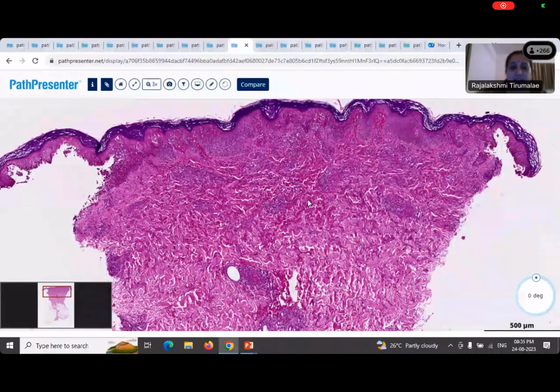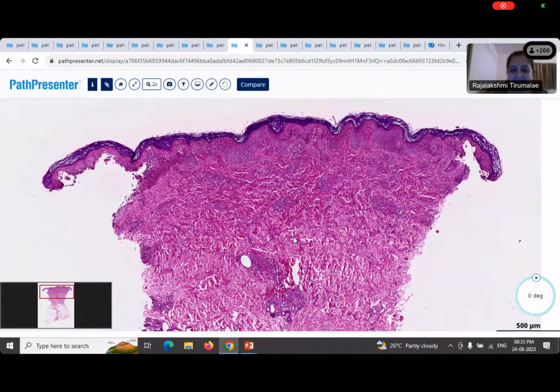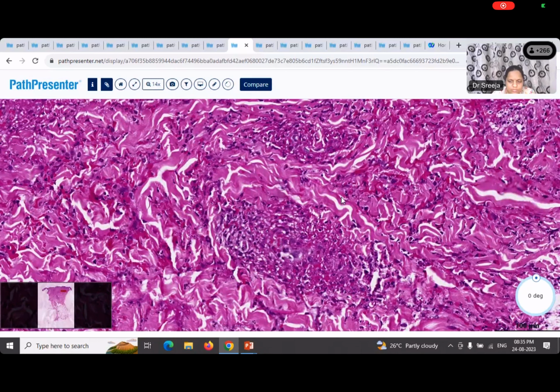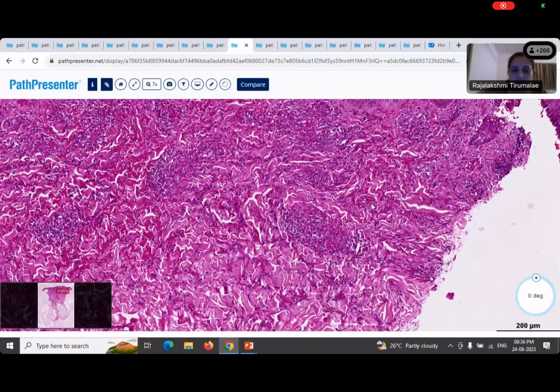It's not because the section is thick. Does it look very pink or very red to you? Yes, it does. Yeah, that's right. Okay, now go to the infiltrate. What do you see here? You're right in that it appears nodular, but where is it? Is it centered around some particular structures? Perivascular infiltrate, ma'am. Yes, so it is perivascular and also nodular.